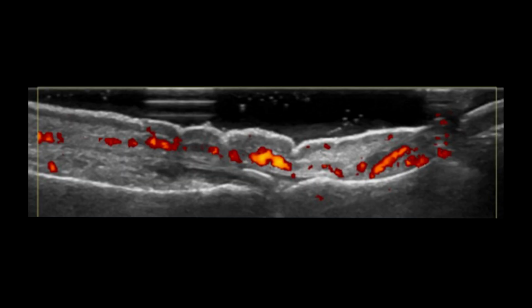In this image, we see a fine hyperechoic linear structure at the insertional region of the extensor tendon. This finding corresponds to an enthesiophyte, as may occur in psoriatic arthritis. In contrast, osteophytes arise from the joint margin and are not located within the enthesis. On ultrasound, distinguishing an enthesial bony proliferation from a joint margin osteophyte helps differentiate DIP joint involvement in psoriatic arthritis from active osteoarthritis.